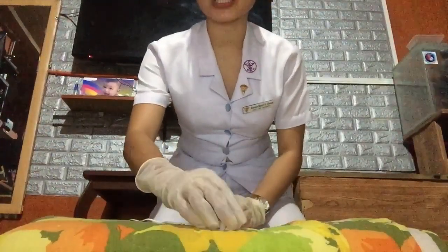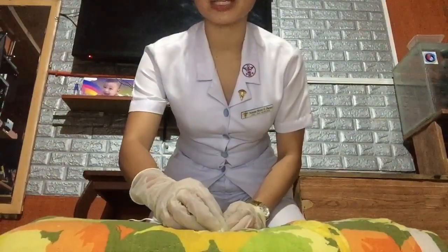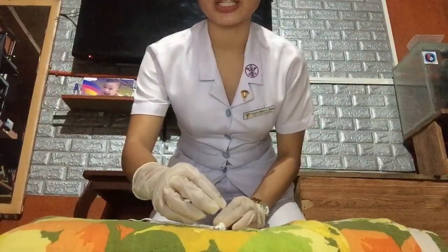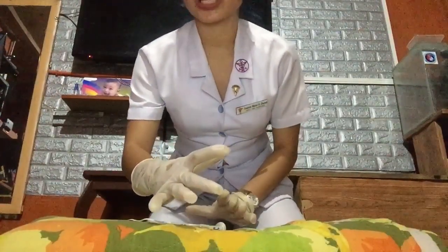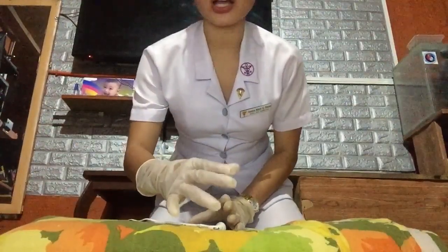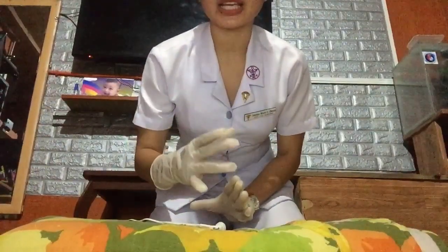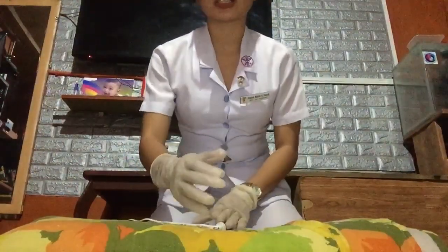The AED will start analyzing the heart's rhythm, and it might tell us to stop the compressions and rescue breaths as it is analyzing. It will then deliver an electric shock, so make sure to clear the surroundings. Everybody clear, delivering the shock in 1, 2, 3. Shock delivered.